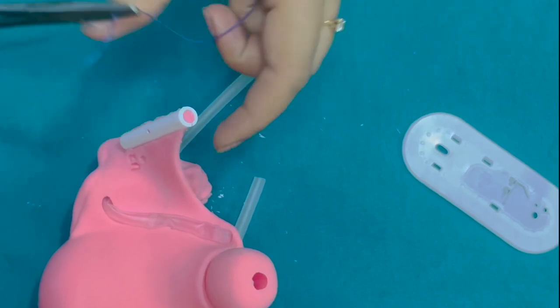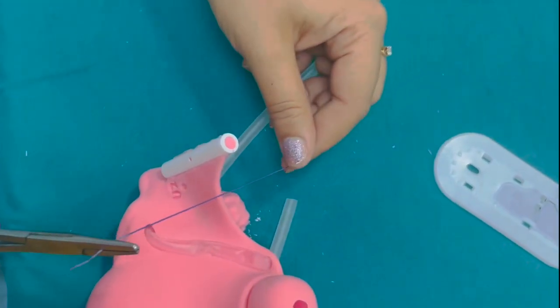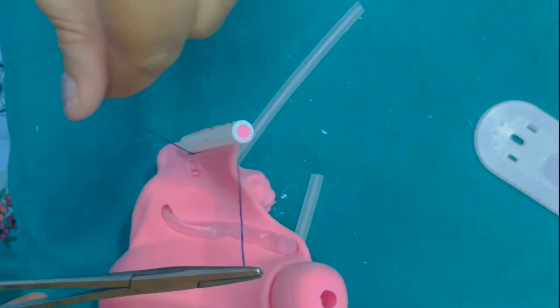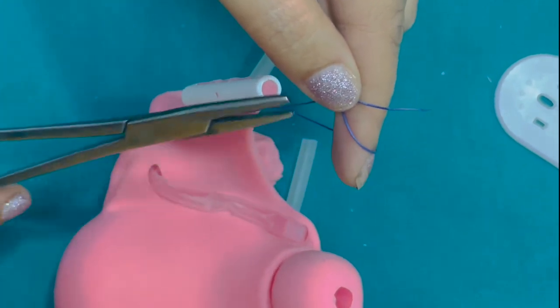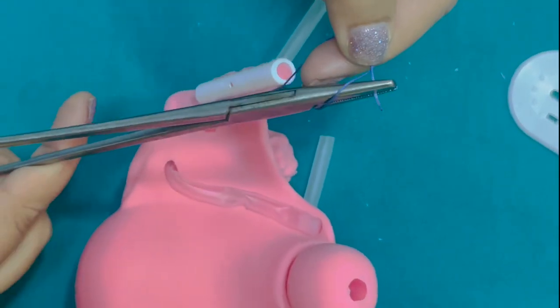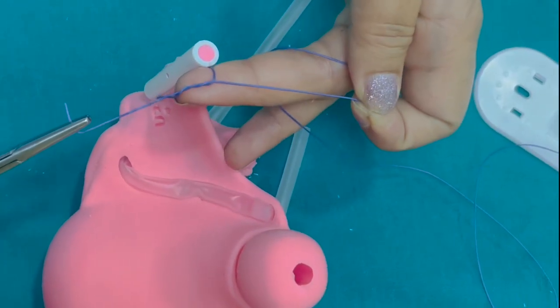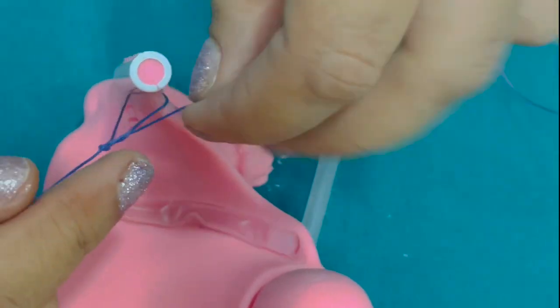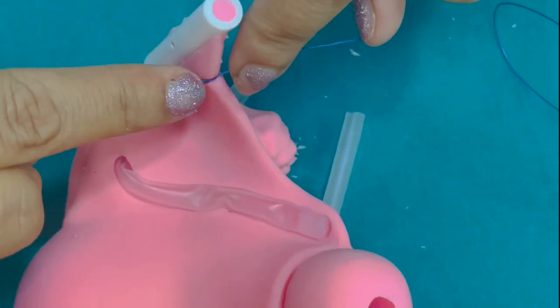For the free tie, hold the suture material from the tip with the needle holder and take it all around the clamp. From the back of your finger, bring it in front and cross with the short suture material — put a cross here. Then take the free end inside the circle twice. Check the direction of your knot — if the hands are positioned incorrectly, it becomes a wrong knot. Place the knot properly, then use index finger on one side and thumb on the other to slowly tighten it.